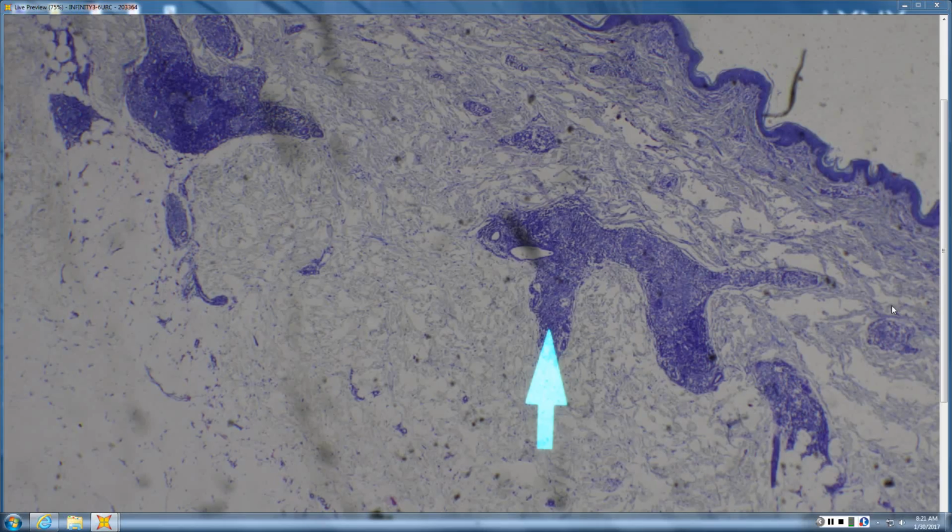So indeterminate leprosy is an early lesion that hasn't decided whether it is going to go tuberculoid or lepromatous. It's that early stage of leprosy that could go either way.